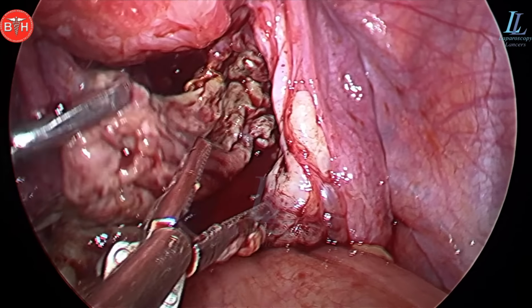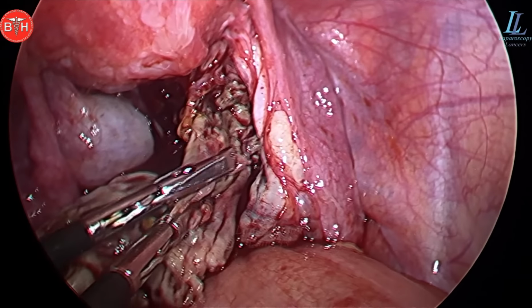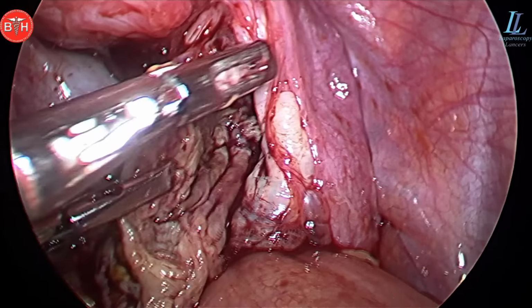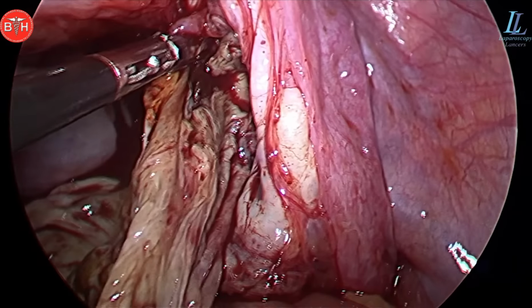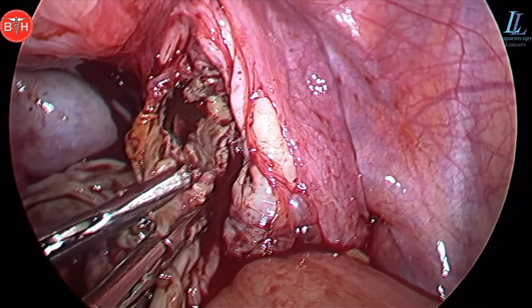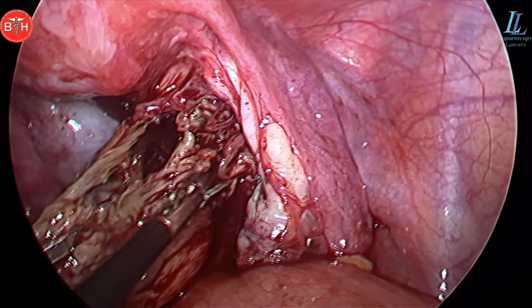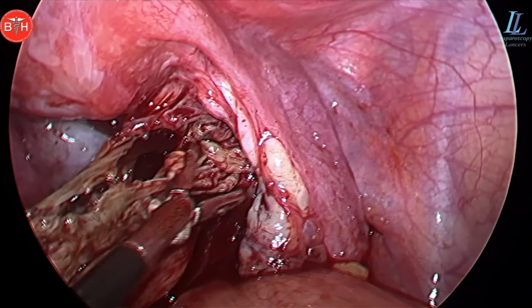And there the second cyst, look how big it was. If I would have been happy with the first cyst, this second cyst would have left and it would be a very big blunder. So be cool, be patient, and keep searching. And if you search, you can even find God, as the preaching goes.